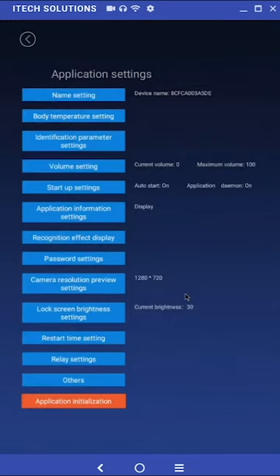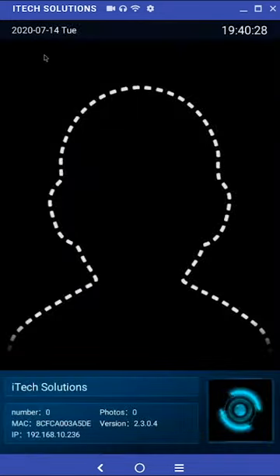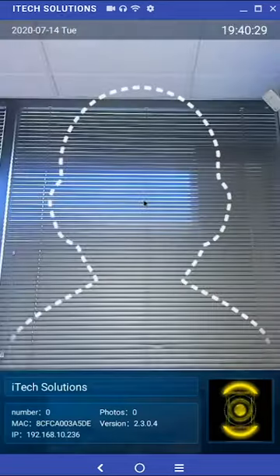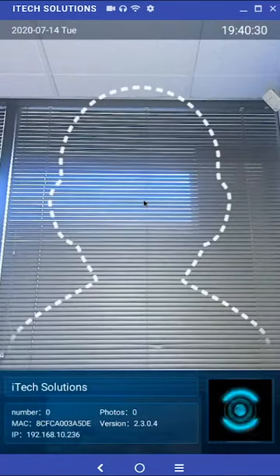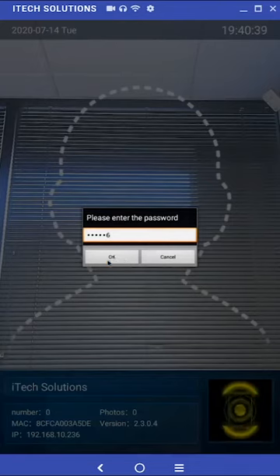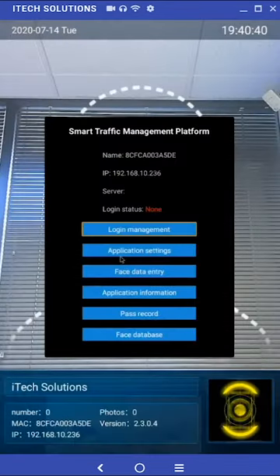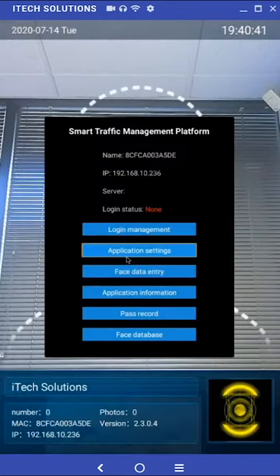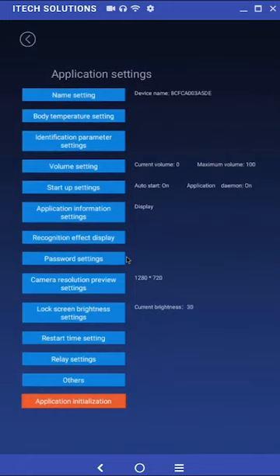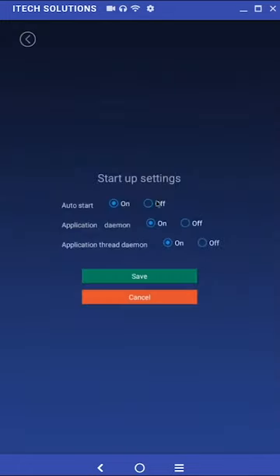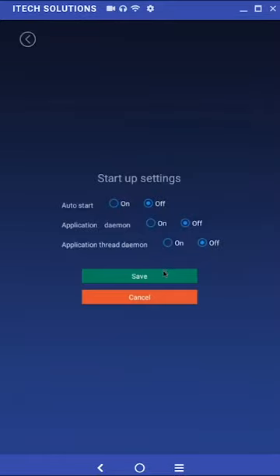Now that we have all the application settings ready we will need to access wi-fi settings and time zone settings on the android device. We first need to select startup settings in the application settings submenu. Next we are going to select off for all three options: auto start, application daemon, and application thread daemons.